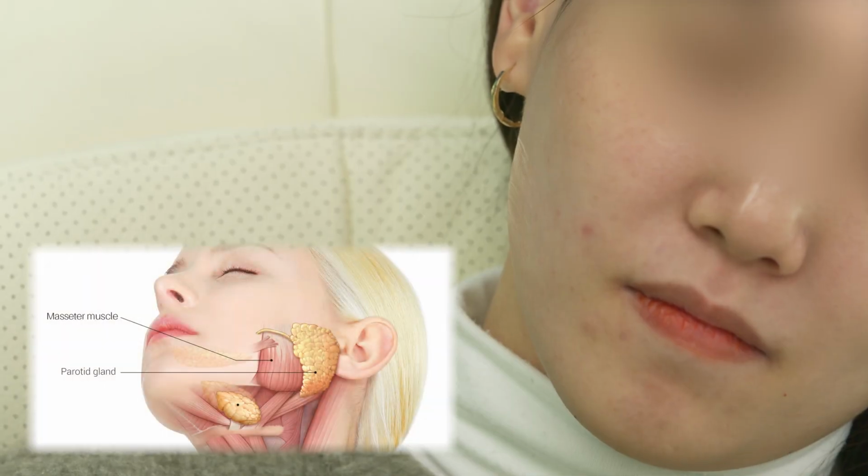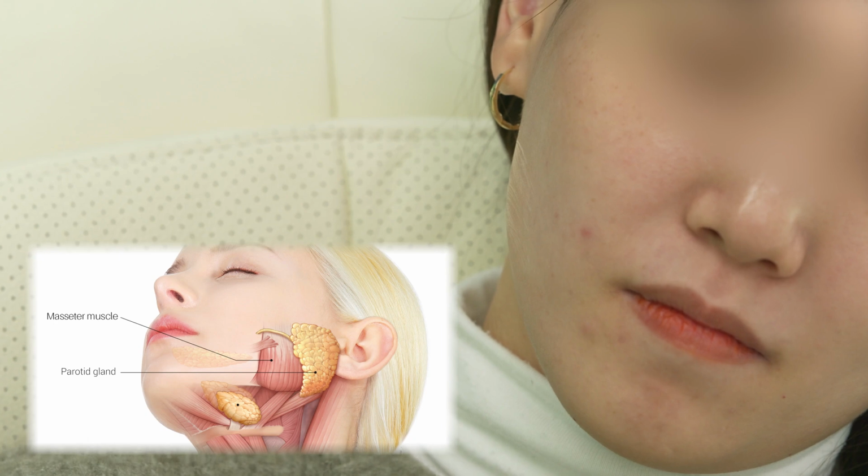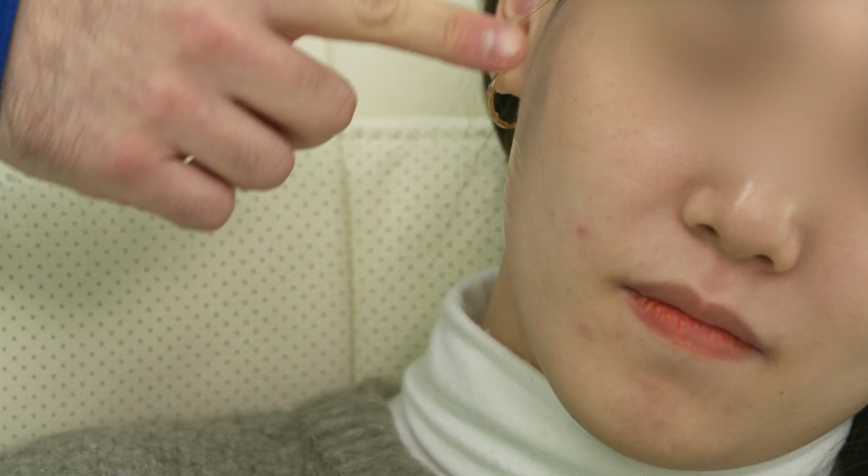The masseter muscle is one of the muscles in charge of mastication, and it can bulge, producing a non-smooth contour. However, it can be treated with botulinum toxin to reduce its bulging state. Due to its size, it is easy to see during the ultrasonographic scan.